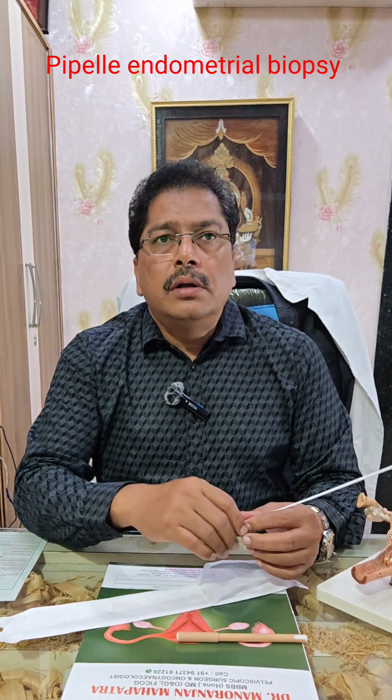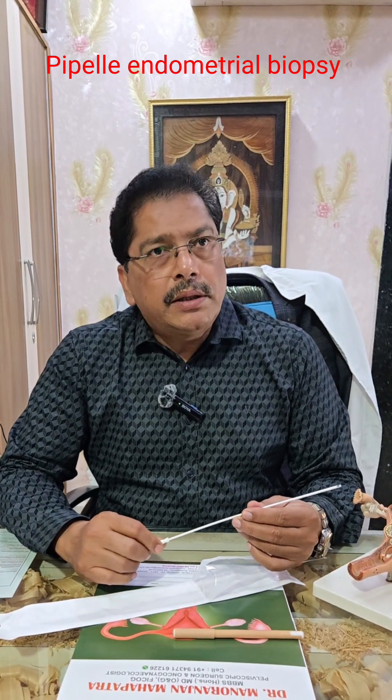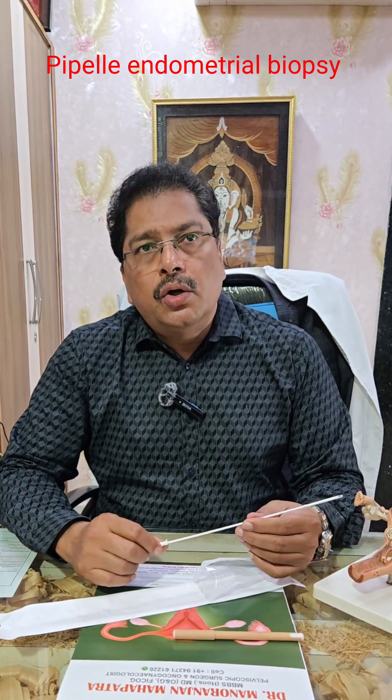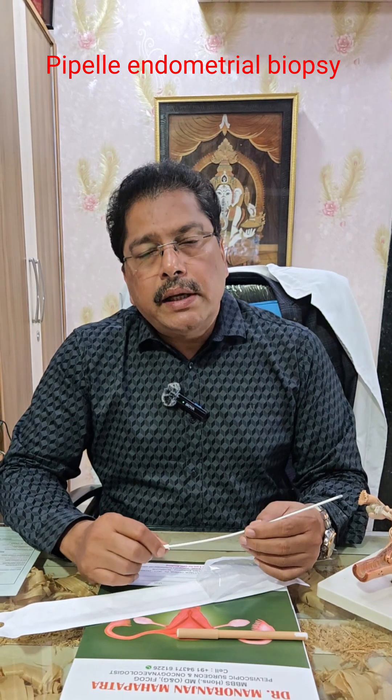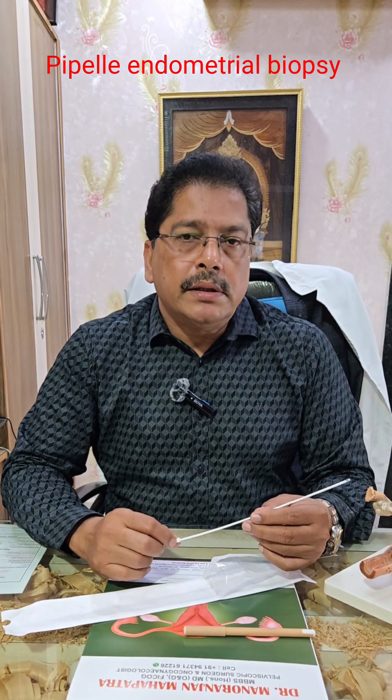To conclude, the Pipelle endometrial biopsy is a very good, simple, non-invasive method to screen and diagnose endometrial pathology, particularly malignancy. Thank you.